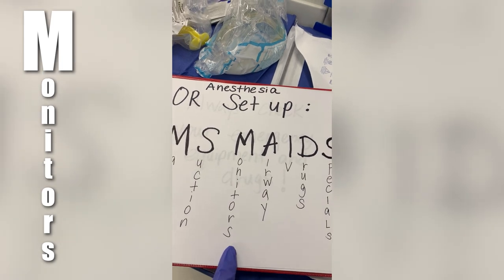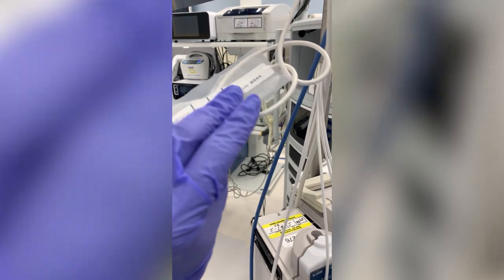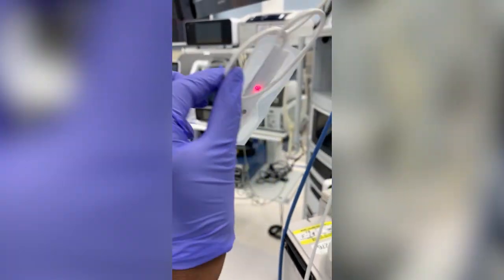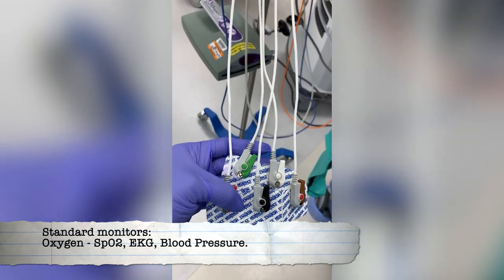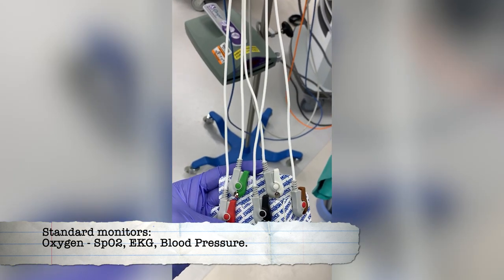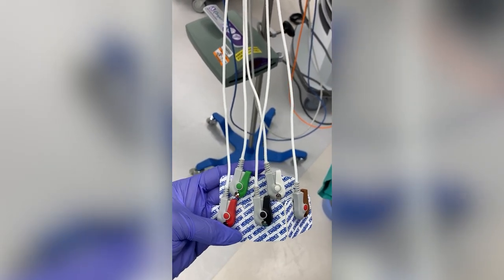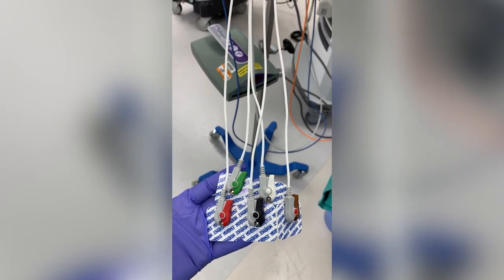Your monitors. So monitors include blood pressure cuff, pulse oximeter, usually use a nice sticker probe for that, and EKG leads. So EKG, electrocardiogram, is a way to monitor the heart's rate and rhythm while people are asleep so that we can make sure that there is no change from their normal baseline heart function. And if there is, we can intervene pretty quickly to fix.